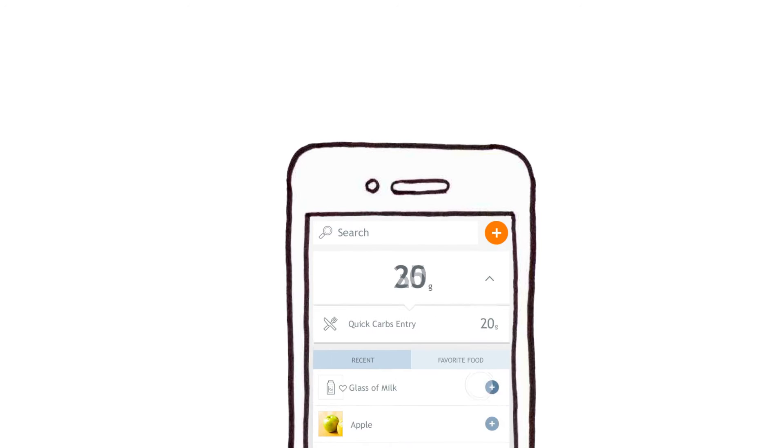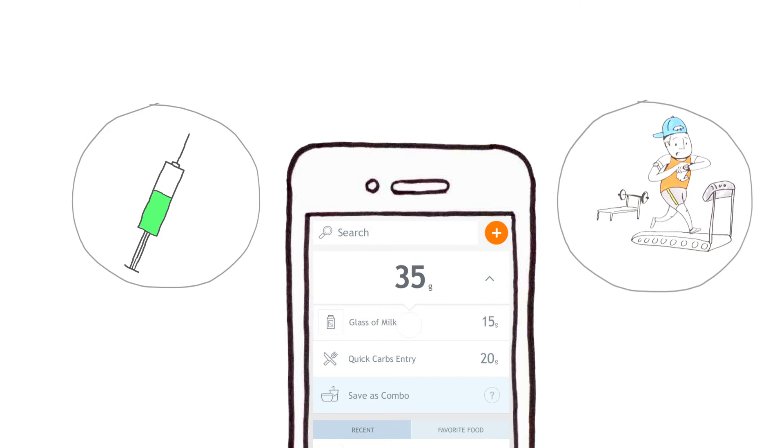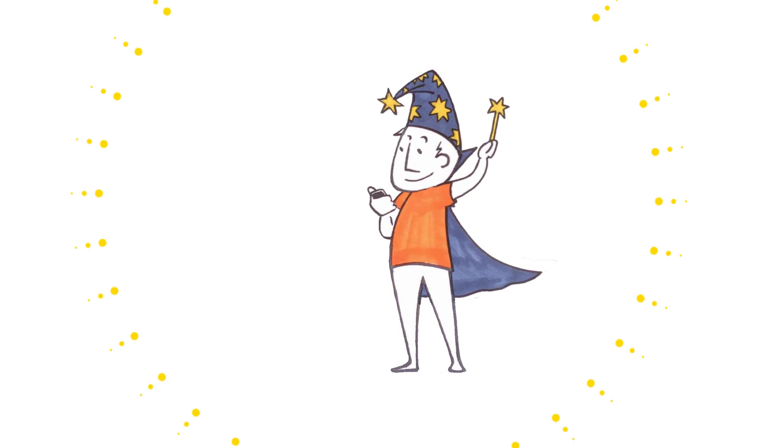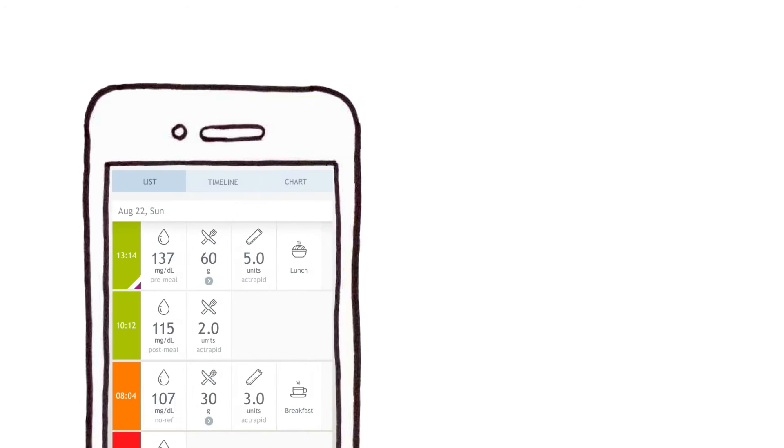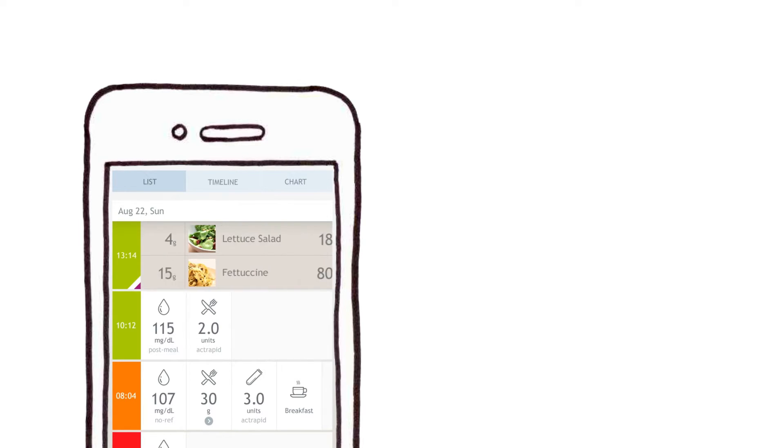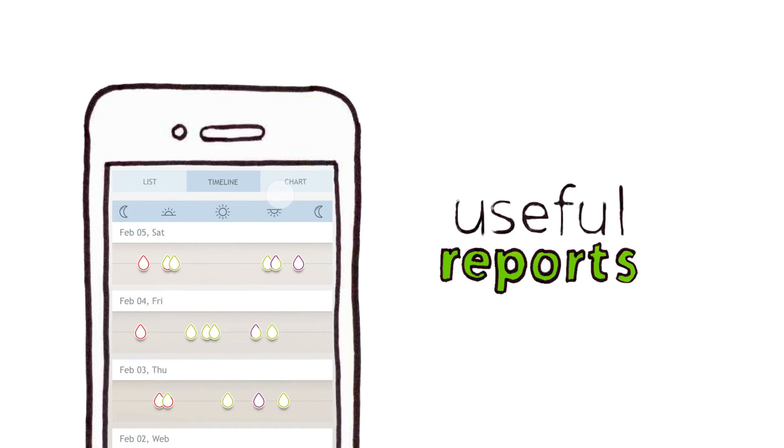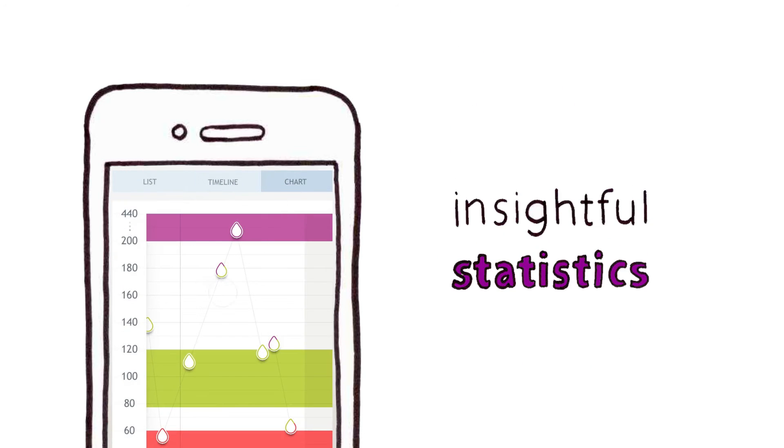Daria can even track insulin and exercise too. Then the magic happens. Daria pulls everything together into beautiful reports that help you understand exactly what's happening inside of your body.